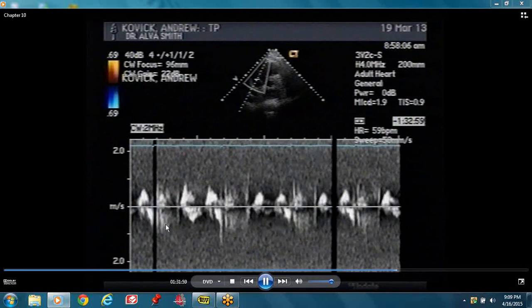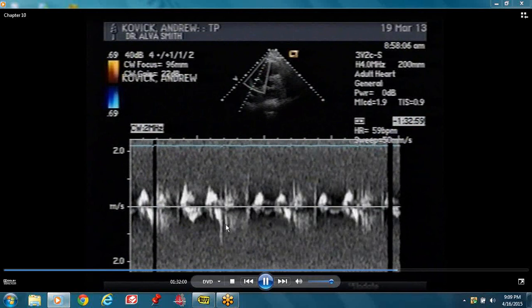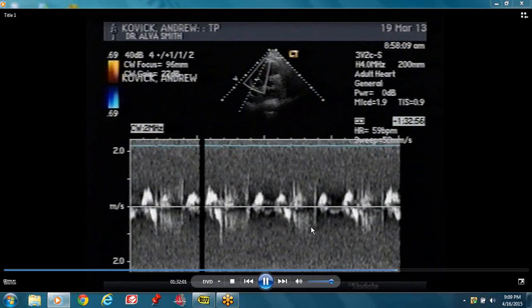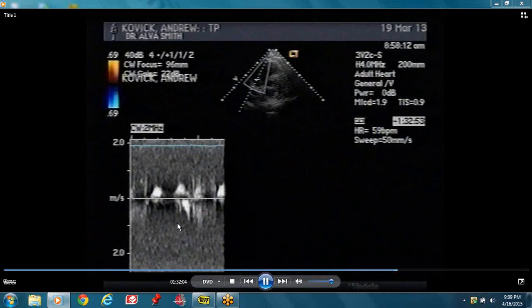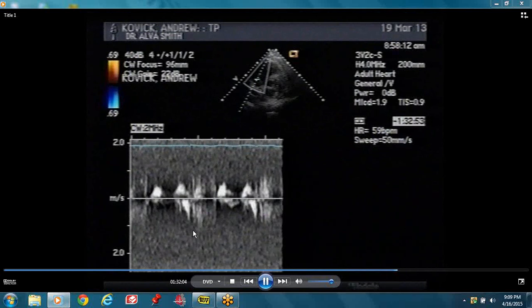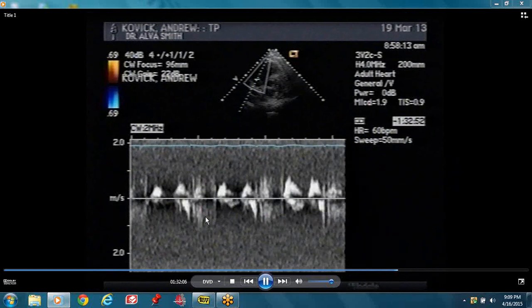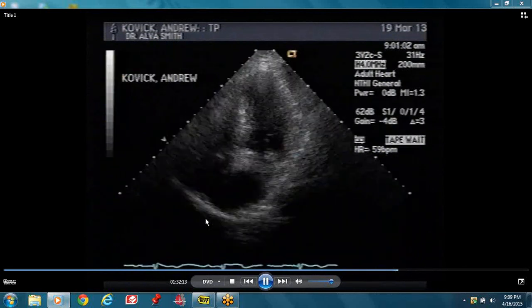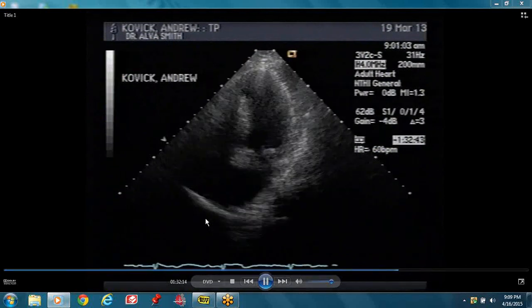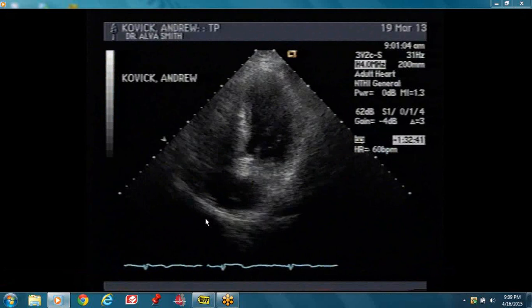There's a small amount of TR — there's a systolic signal which is coming in below the baseline, consistent with tricuspid regurgitation.